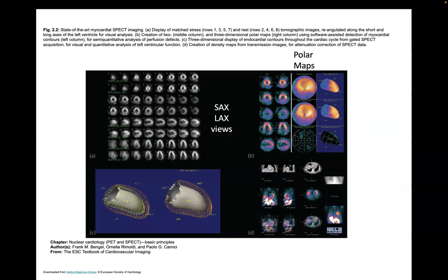The good news is, if you are the cardiologist, it gives you a lot of freedom to keep pushing the patient through a diagnostic protocol or stopping and saying, oh, you're fine. Which sounds kind of ironic. You say, well, do you really want to give a physician that much freedom because the data is noisy?